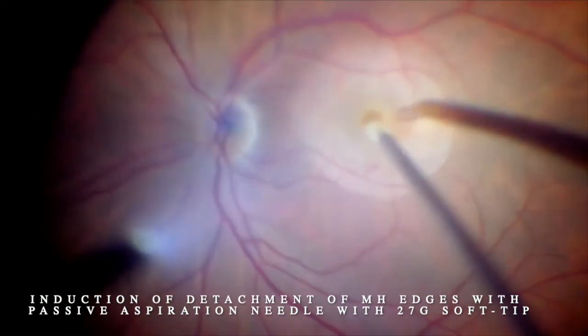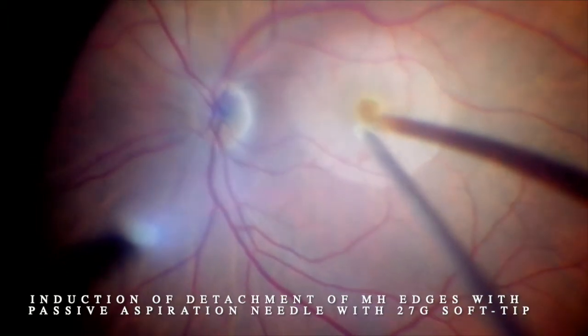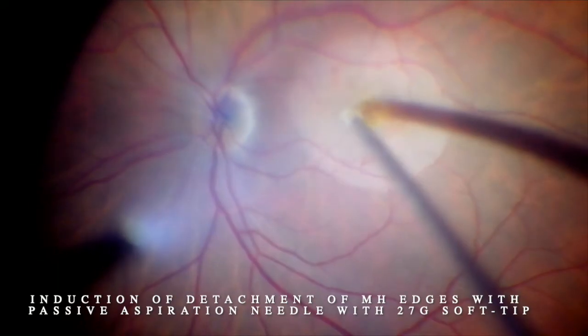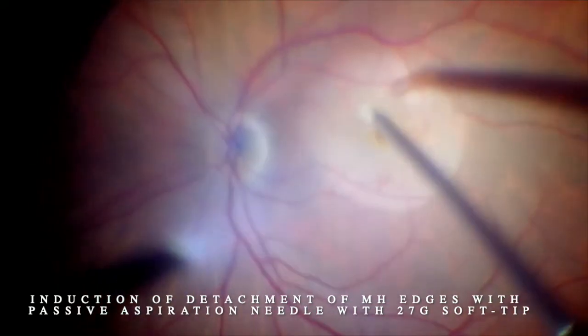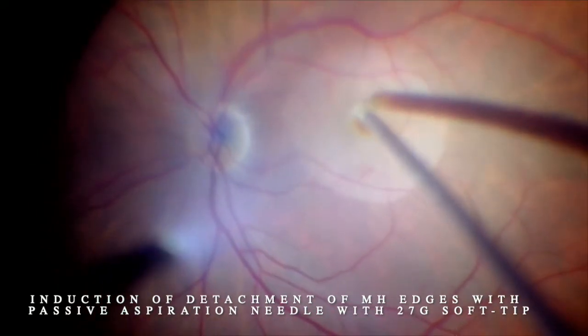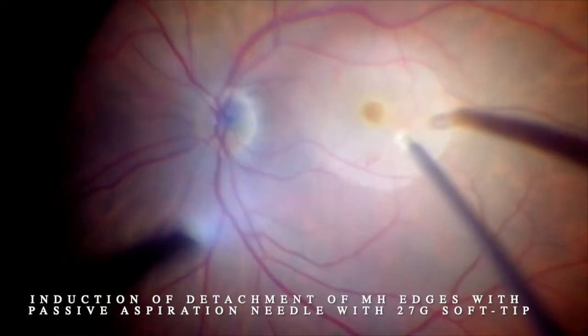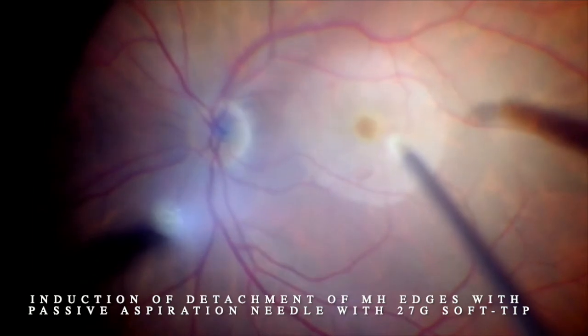Now what I'm doing is inducing a retinal detachment just around the edge of the macular hole. This is a 27 soft-tip needle with passive aspiration.